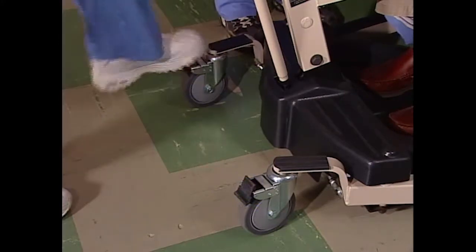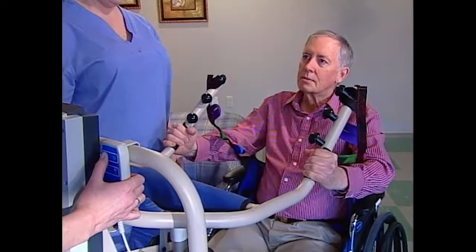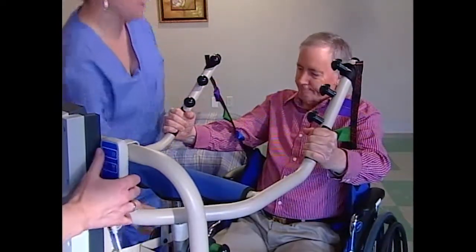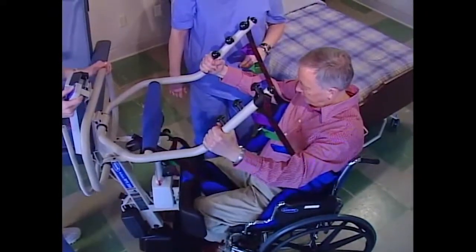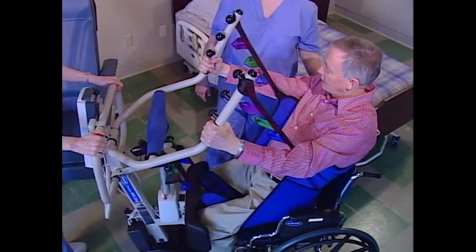Unlock the rear casters so the lift is free to adjust itself to the new center of gravity. Press the up button on the hand pendant to put a little weight on the sling. Before going any further, double check the attachment points to make sure they're properly secured. Raise the resident above the surface of the wheelchair just high enough so they clear the surface. Raising them any higher with this type of sling can result in injury. Their weight is now fully supported by the lift.